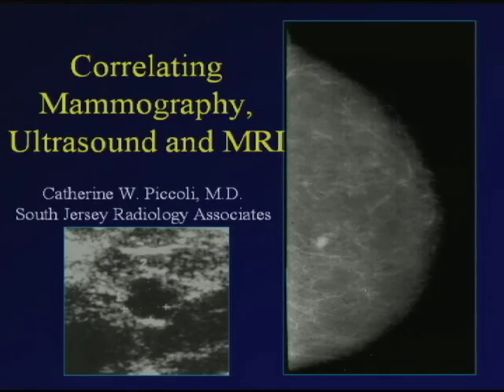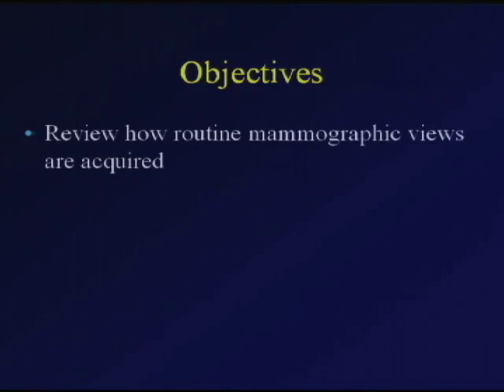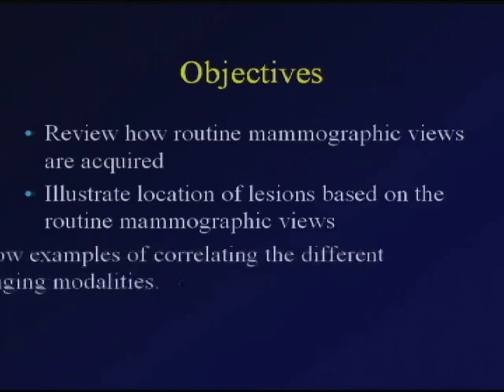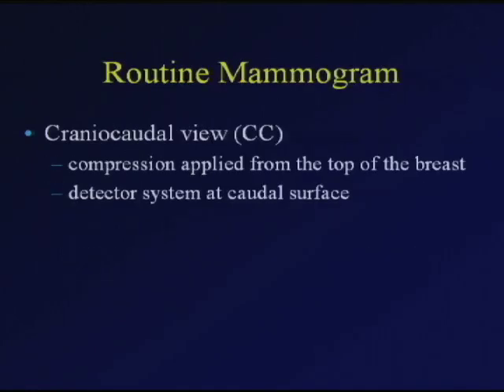My name is Dr. Catherine Piccoli, and I'm going to be talking about correlating mammography, ultrasound, and MRI. The objectives of this talk are to review how routine mammographic views are acquired, to illustrate the location of the lesions based on the routine mammographic views, and to show examples of how we correlate the different imaging modalities when we see an abnormal lesion.